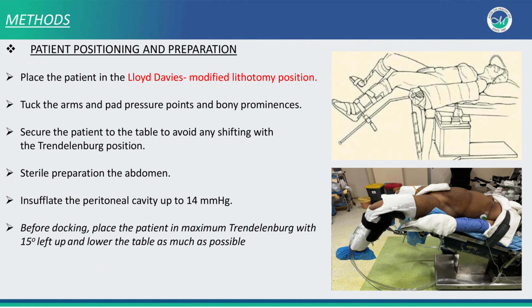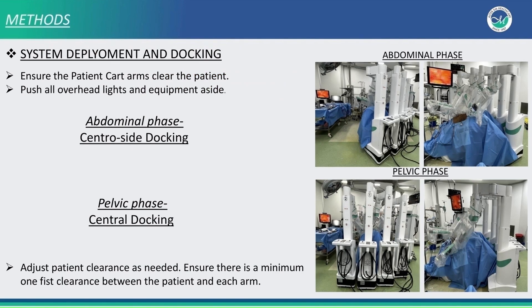The patient is positioned in Lloyd-Davies modified lithotomy position. We place the patient in maximum Trendelenburg with 15 degrees left up. For the abdominal phase, we do a centroside docking in which the carts come from the left side of the patient. For the pelvic phase, we do a central docking where the carts are from the front.